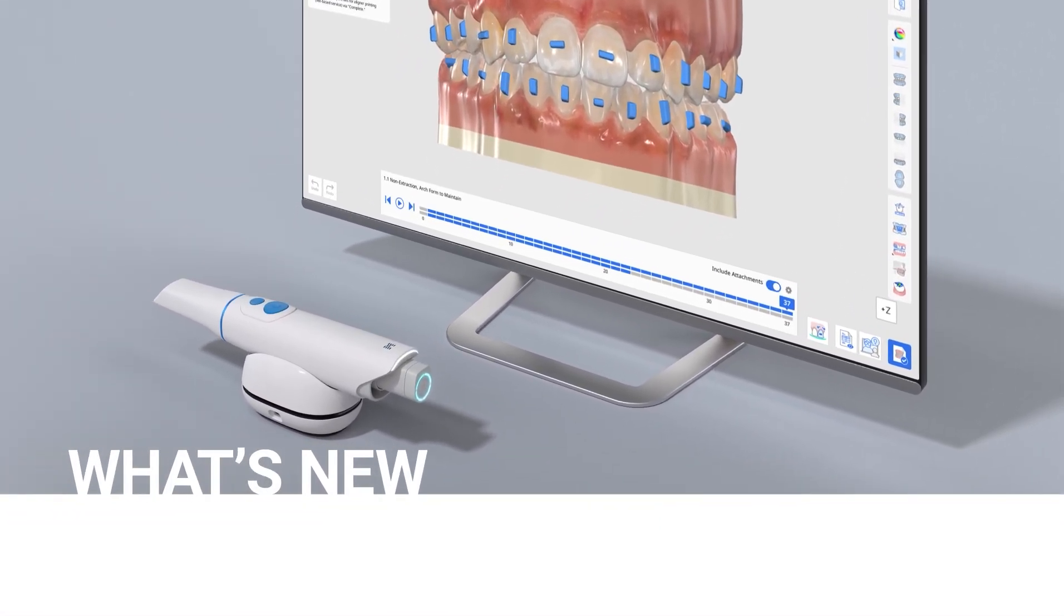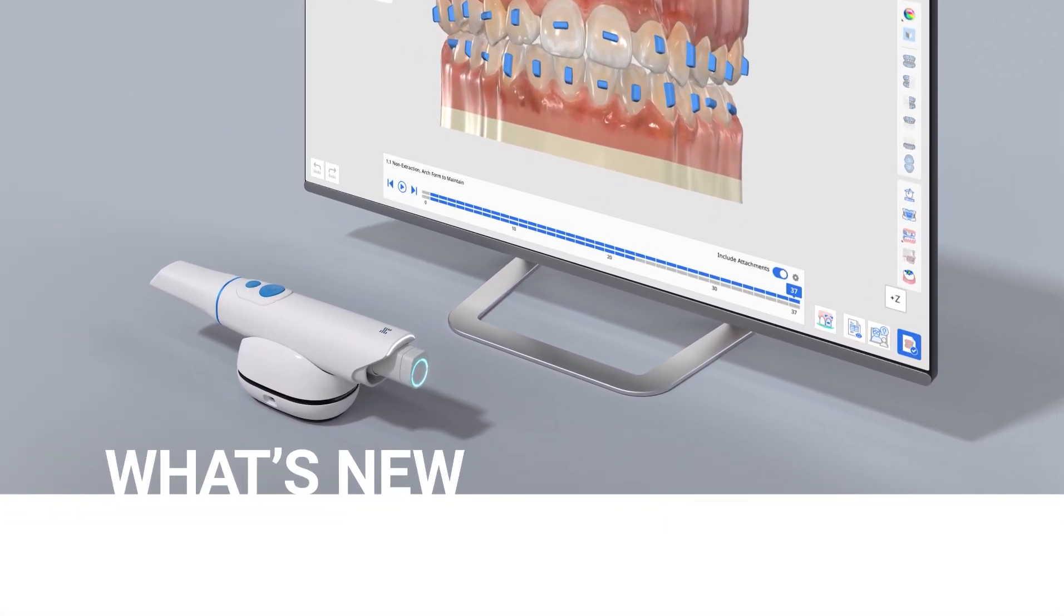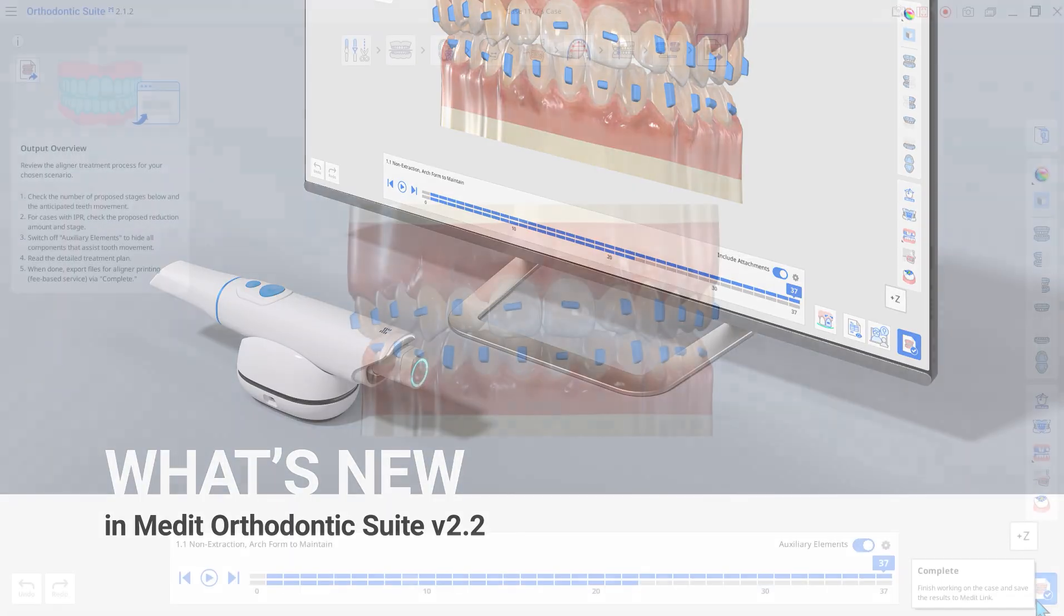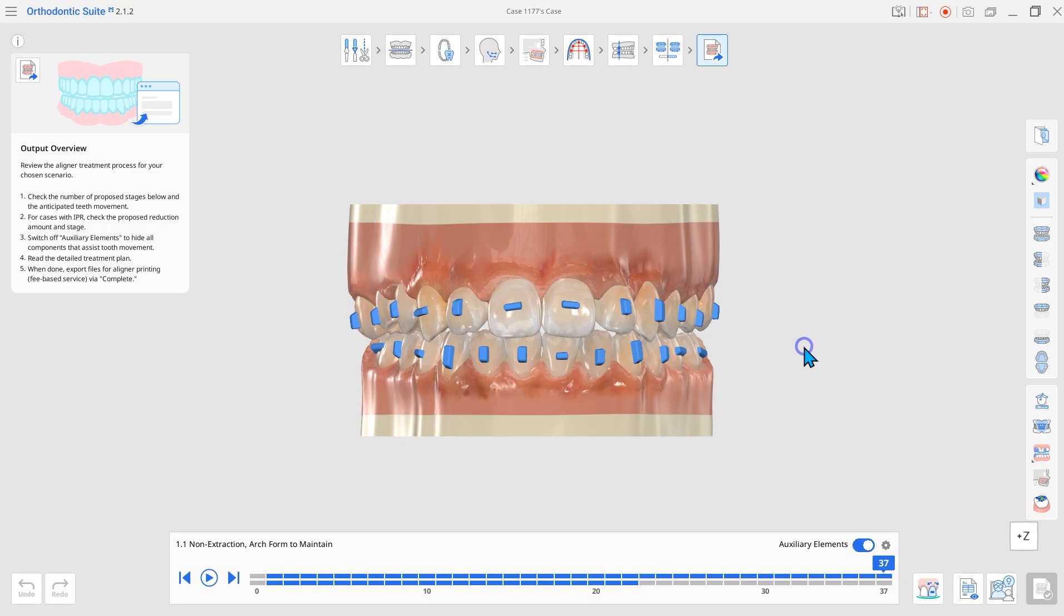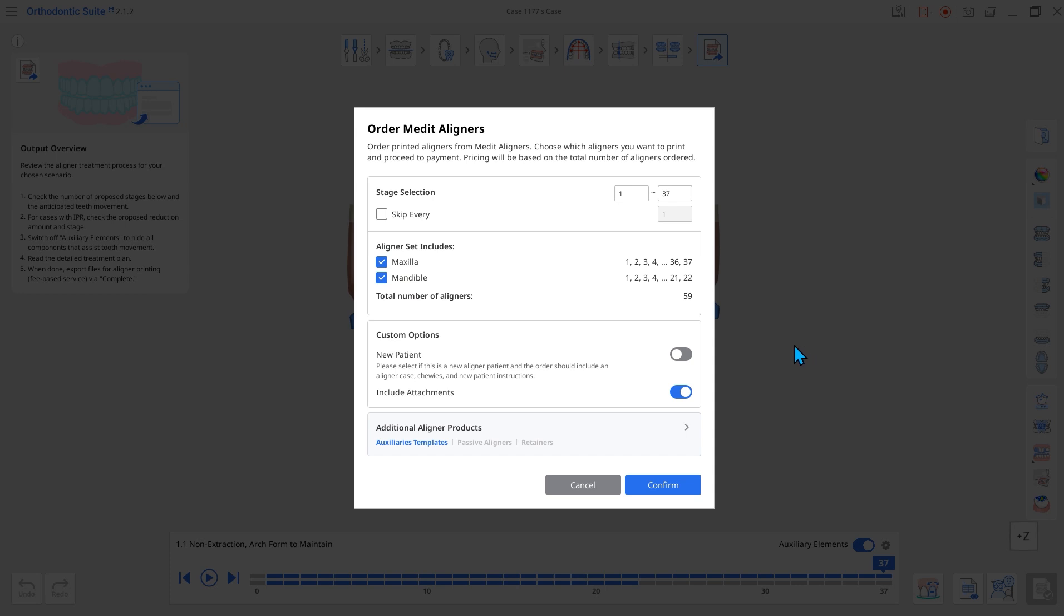Let's look at the updates in Medit Orthodontic Suite version 2.2. First, a set of new products has been added to Auto Medit aligners.